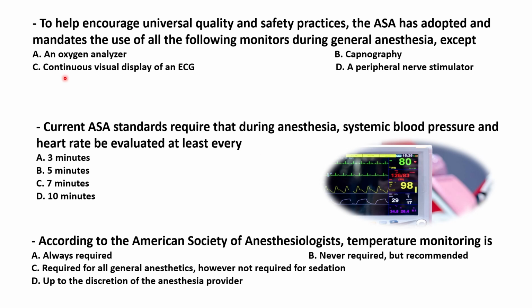The first question: to help encourage universal quality and safety practices, the ASA has adopted and mandates the use of all of the following monitoring during general anesthesia, except: oxygen analyzer. This is used for oxygenation, so it's correct. Capnography, this is to monitor carbon dioxide, so it's correct. Continuous visual display of ECG, this is for circulation, it's correct.